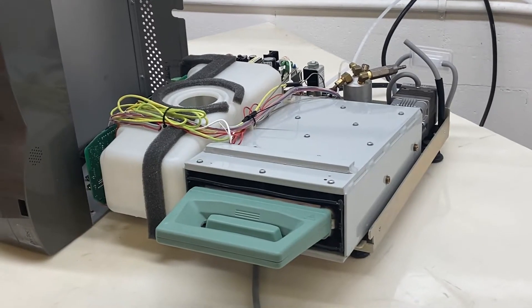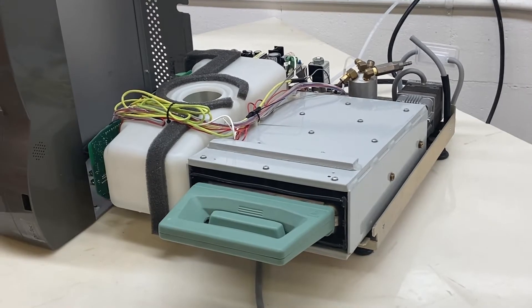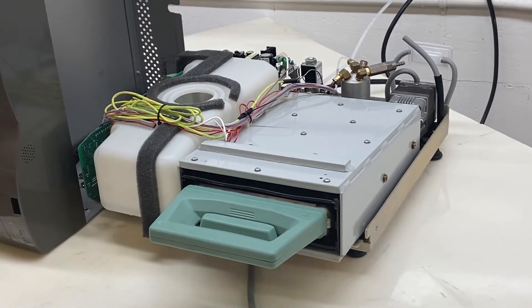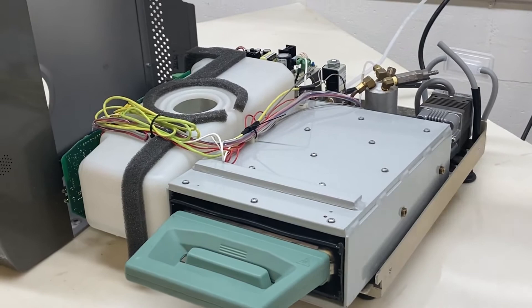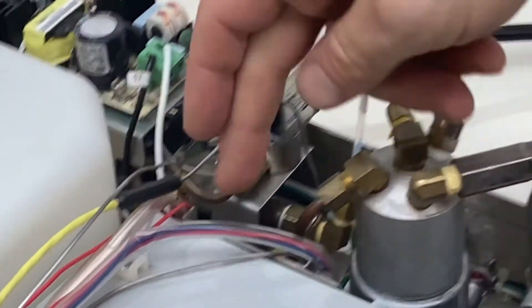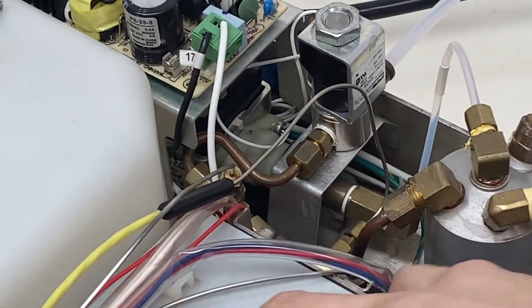Sterilizer autoclave solutions — Cycle Fault 19. The validation thermocouple calibration is invalid. It could be the validation thermocouple, which is back here. It runs in line from the solenoid to the chamber, which is the cassette.